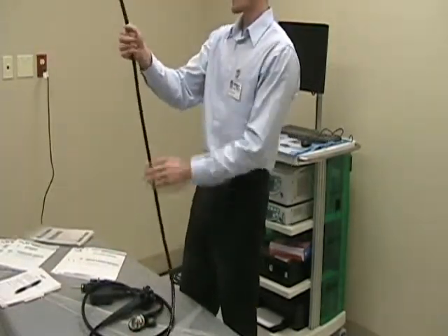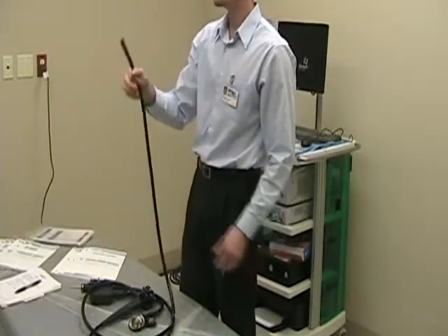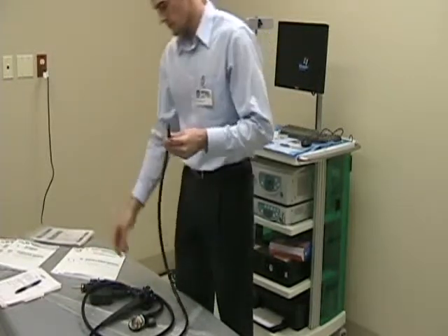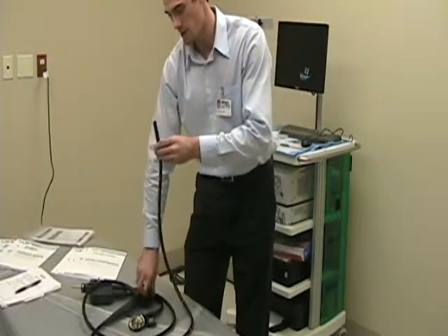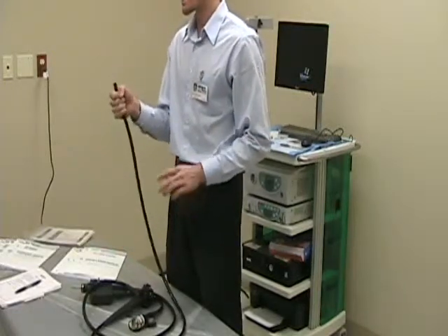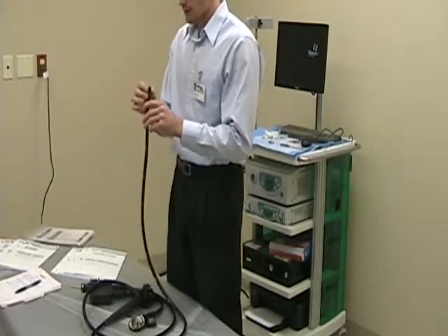Important to note, these last like 5 inches are probably one of the most expensive parts on the scope. So you want to just be mindful of that and take care of it. Because there's a little camera in there, there's a little prism, there's all these little cables that articulate the scope, all located there. So whenever you handle a scope, pick it up, you want to have some control of this end at all times. So no smacking it, hitting it, that can crack, break cameras.